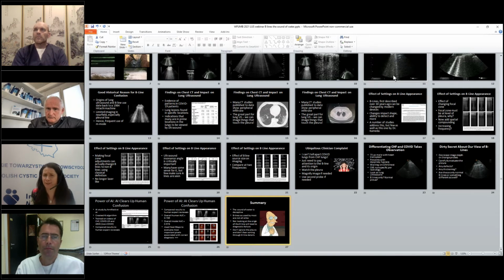It's easier. For example, we took smaller consolidations up to 1 centimeter, and then we just write if they are numerous or singular and in which zone. If we have larger consolidations, larger meaning above 1 centimeter in the biggest dimension, then we also describe at least 2 dimensions, if possible 3 dimensions, so that then we can compare.